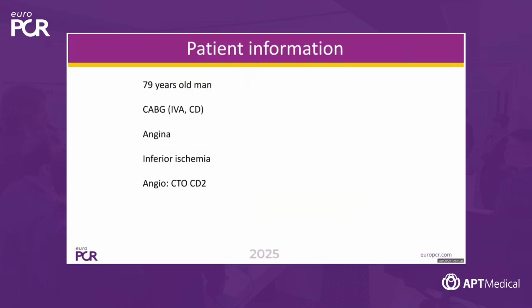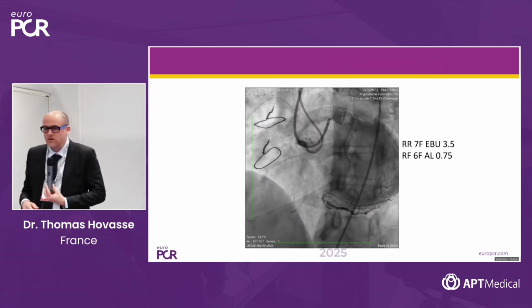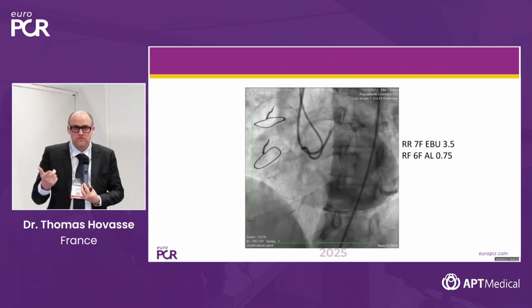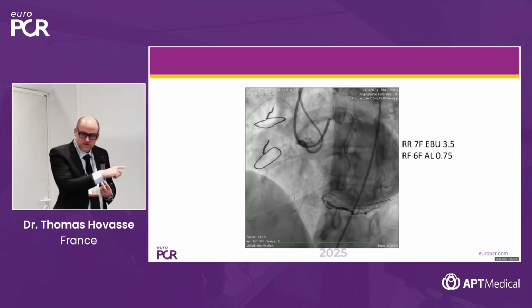So this is the case. I will ask some questions. What do you think of this right CTO? Easy one, tough one? What are the criteria you are looking for? So it's a long CTO.